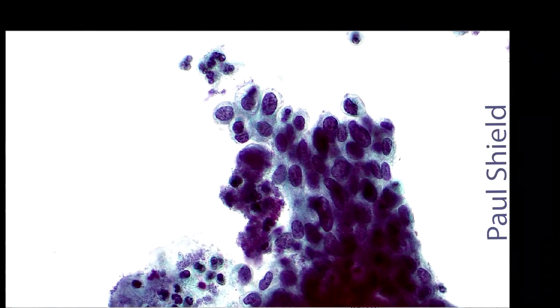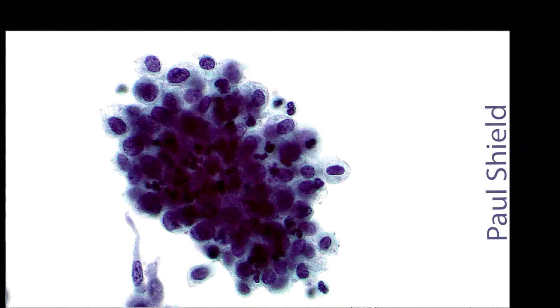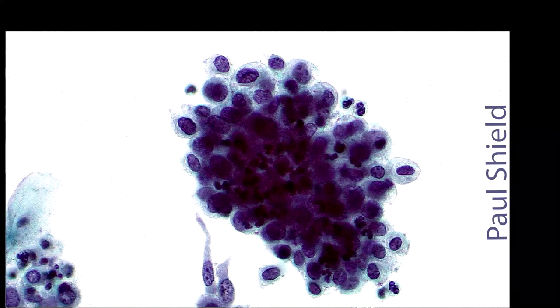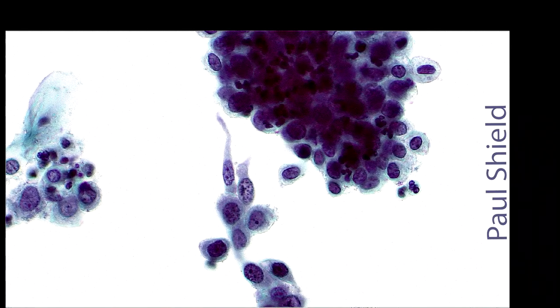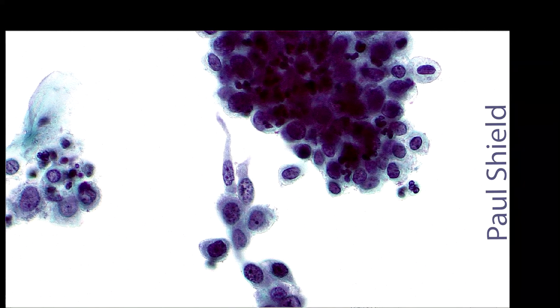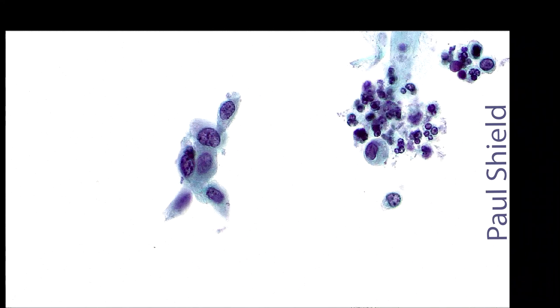Another group, this is extremely hyperchromatic, I can't really even see in the middle. Almost looks like endometrial cells, doesn't it? But there is much too much variation in size and shape amongst these cells that you can see around the outside, just another group, for them to be endometrial. Very high NC ratios, and this one's showing a couple of spindly type cells in the middle there, and that's typical of squamous differentiation. And if I see that, I'm thinking high-grade squamous intraepithelial lesion. Again, just a couple of cells showing that irregular nuclear membrane, so little indents and notches in it.